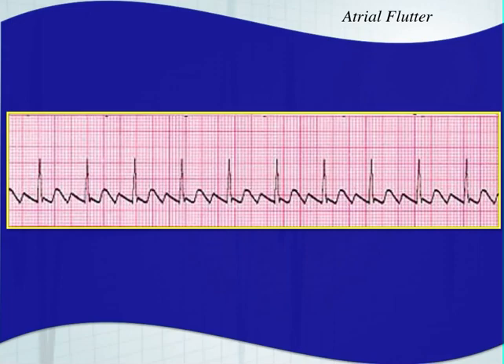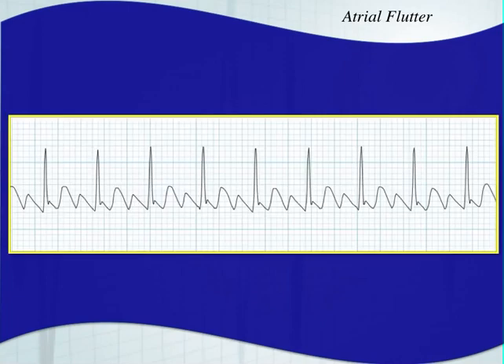Here's another example of atrial flutter that a lot of people might miss, thinking the flutter wave is a T wave and this one is a P wave. But if you continue drawing in the flutter waves, you can see this is an atrial flutter — in fact a three to one atrial flutter, which typically occurs around 100 beats per minute. These F waves become hidden, which makes them so hard to identify. Sometimes you have to look at them upside down — if you flip the rhythm you can see the sawtooth pattern a little bit easier.